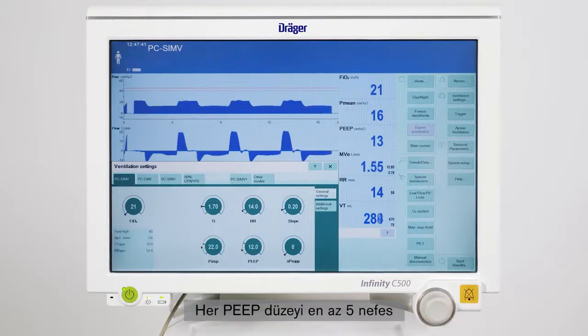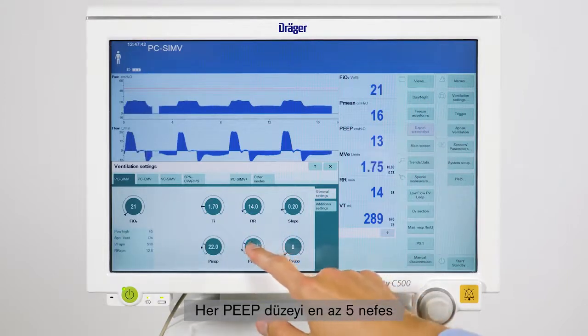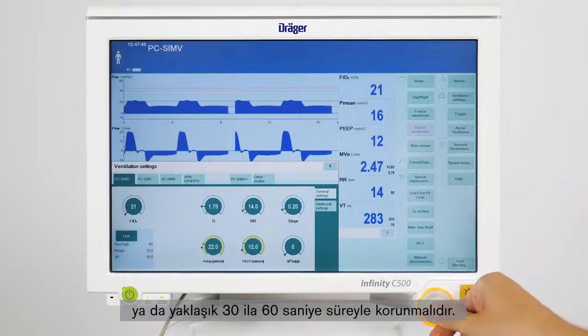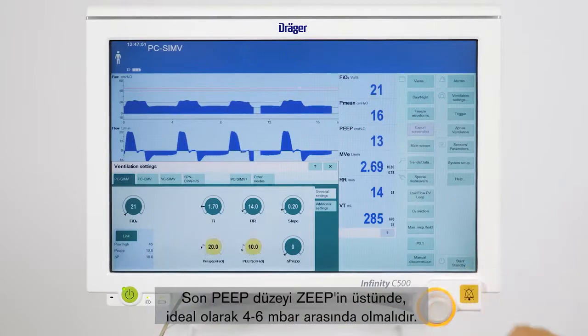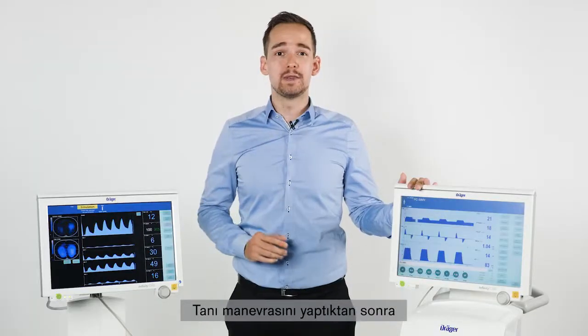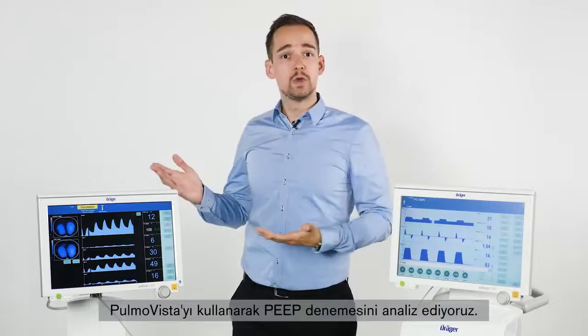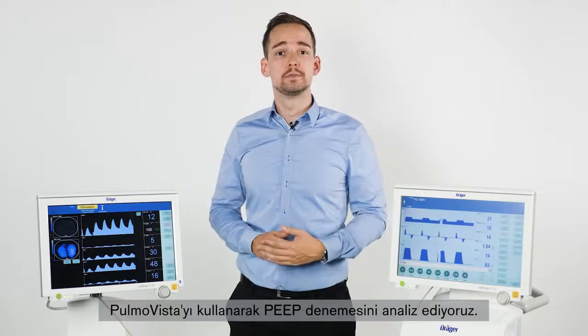Each PEEP level should be held for at least 5 breaths or approximately 30 to 60 seconds. The final PEEP level should be above ZEEP, ideally between 4 and 6 millibar. After performing the diagnostic maneuver, we use PulmoVista to analyze the PEEP trial.